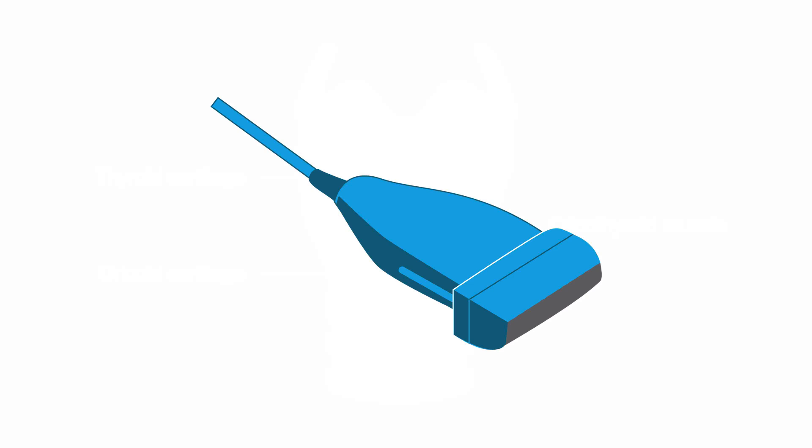We're going to choose a linear, high-frequency transducer to ensure excellent resolution, as the membrane is a superficial structure. To obtain an image of the cricothyroid membrane, place your transducer in a long-axis orientation in the middle of the neck with the indicator pointing towards the patient's head. You're placing the transducer between the thyroid and cricoid cartilage, right where you think you would find the cricothyroid membrane. It's important to keep your hands still and in a vertical plane.